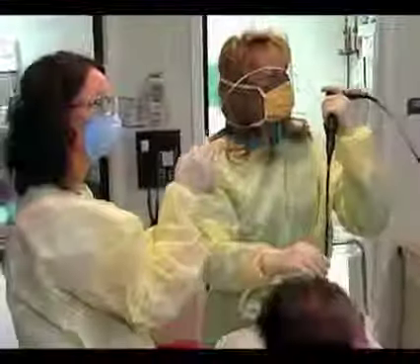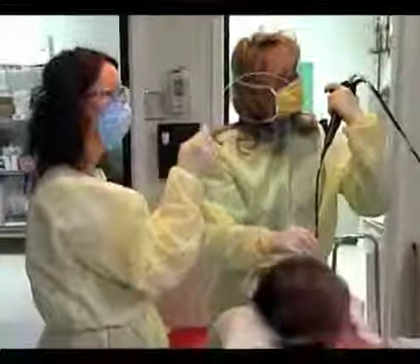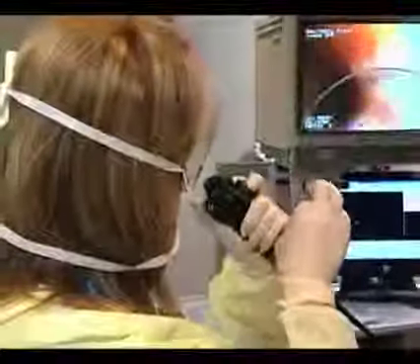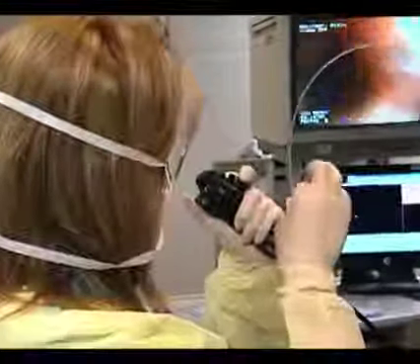So we've just completed the procedure, which is basically a transbronchial needle aspirate of the main carina, trying to address the pathology seen on CAT scan of this individual, which is actually a subcarinal node, relatively low beneath the subcarina. In this case, I ended up taking about 6 passes to make sure I had enough cellular material to hopefully make a diagnosis, to rule out cancer.